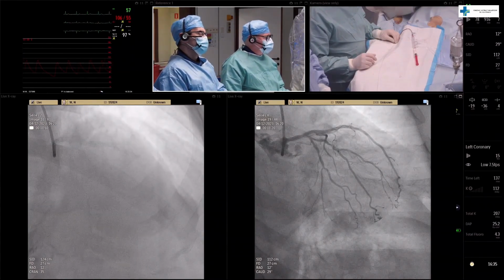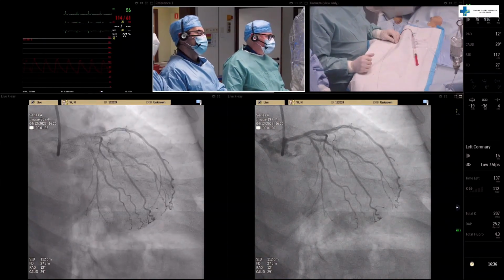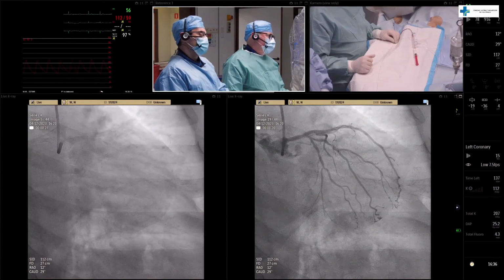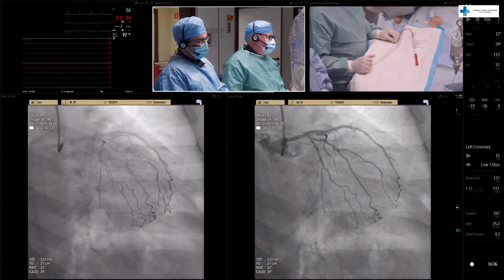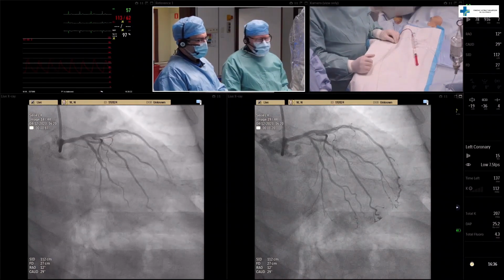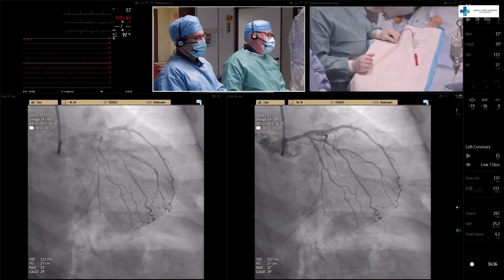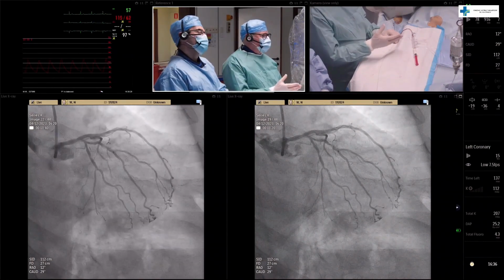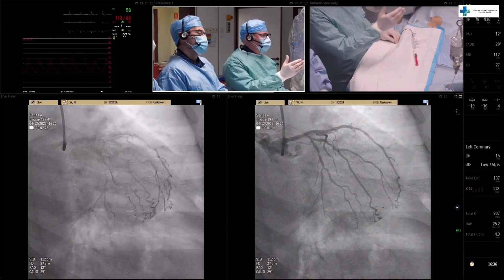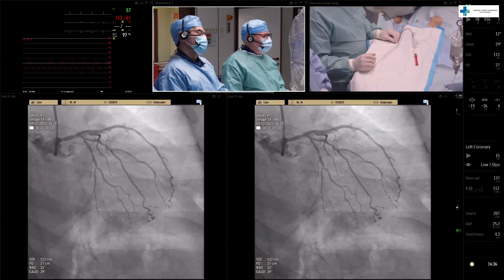And now the next projection. Again, we see that the stenosis in the left main is not so tight. However, we still see a lot of calcium there, and we see the ostium of the circumflex. Of course, it's not very conclusive in regard to the assessment of this ostium, and this is why in such a scenario we can discuss how to treat this patient, what would be our strategy for left main PCI.